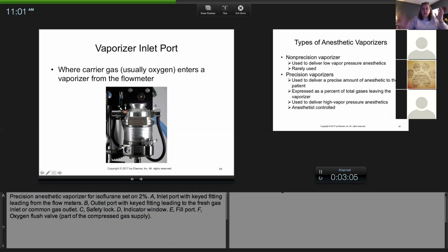Now, in any clinic, you can use your anesthetic machine to just give your animal oxygen. If you have an animal that comes in and they're having a hard time breathing, you could pull the machine over, make sure that this is off, in the off position, and if you turn on the oxygen, oxygen is going to go through port A to port B, but it will only be oxygen, okay? So as long as the vaporizer is off, it's not delivering anesthetic.